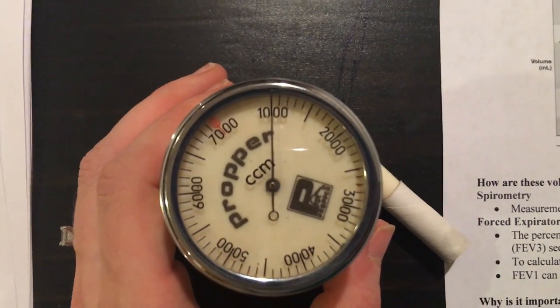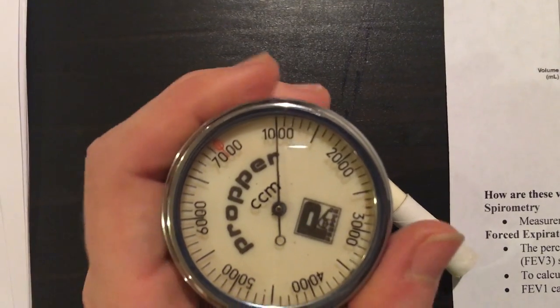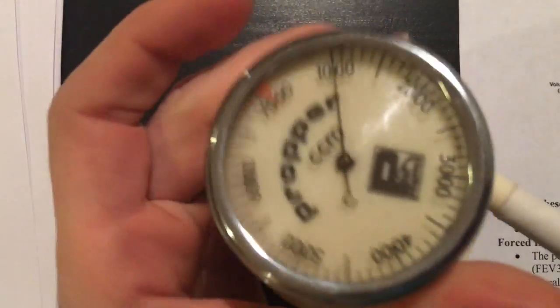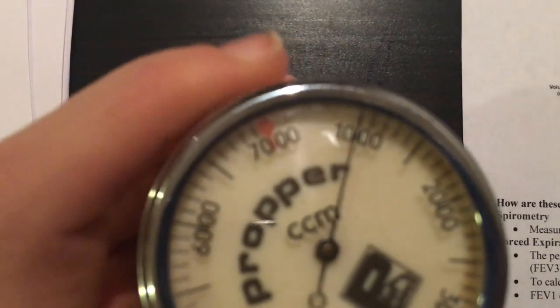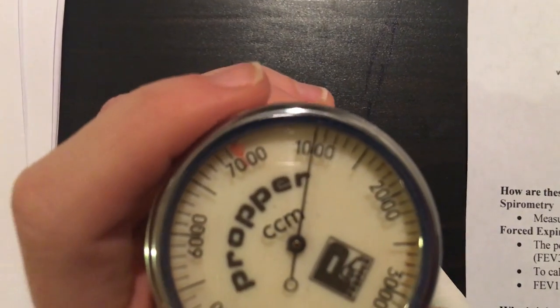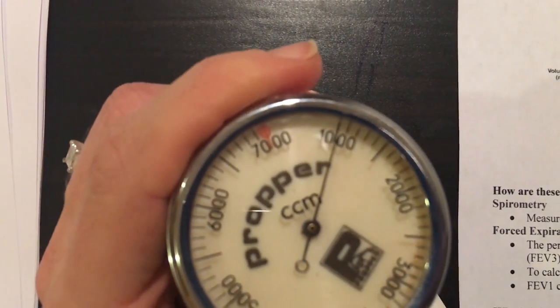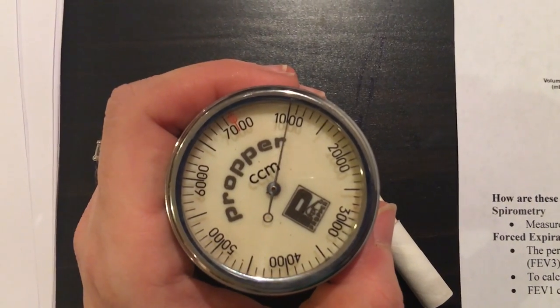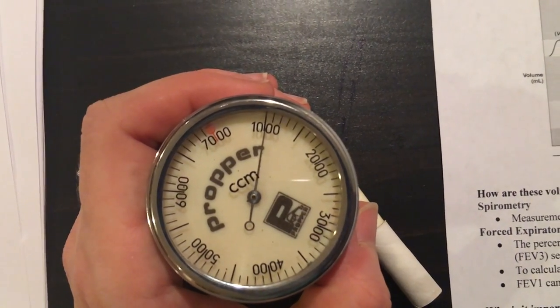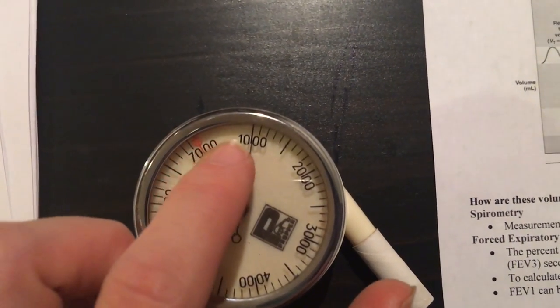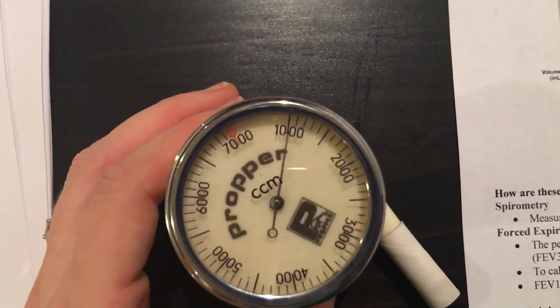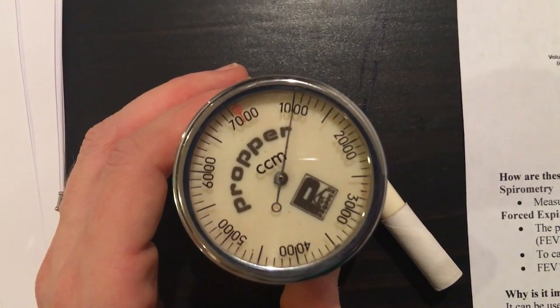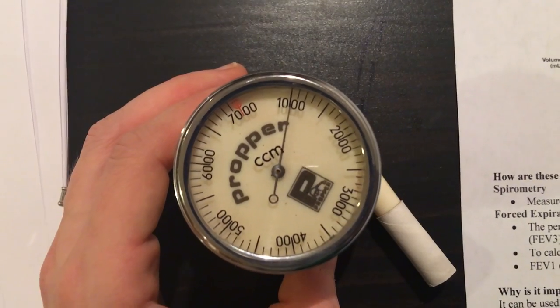I've set it to the dial so you can turn this to set it to zero. I've set it to 1000 to start because we're going to do tidal volume and tidal volume is a small number. There's no dash marks here, and this spirometer is probably not sensitive enough to get an accurate tidal volume, but we're going to do it anyway and see what we get.